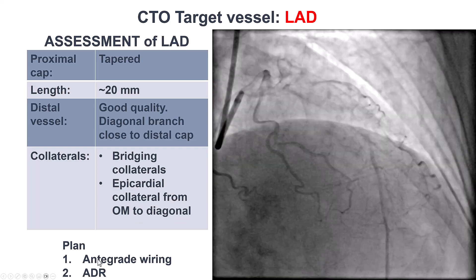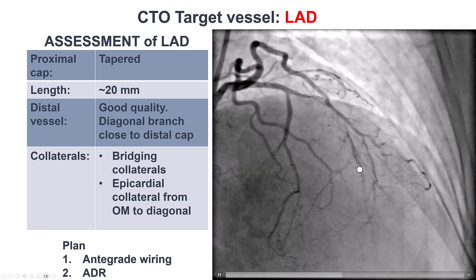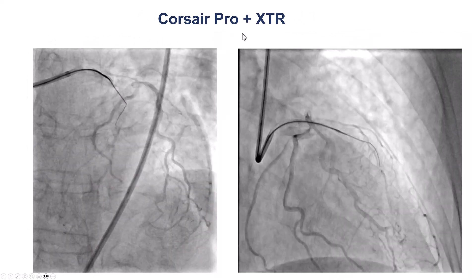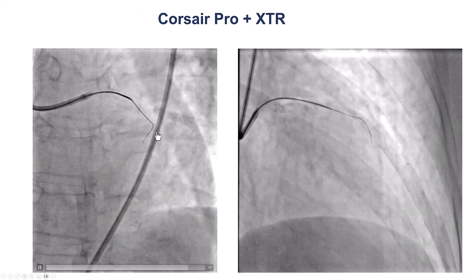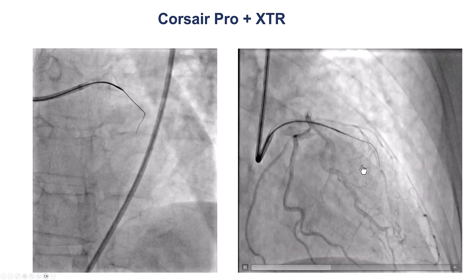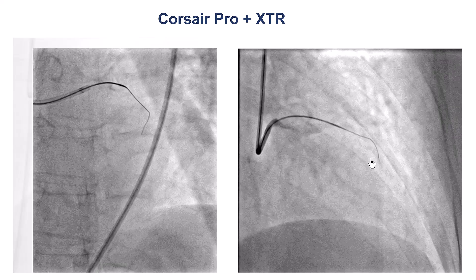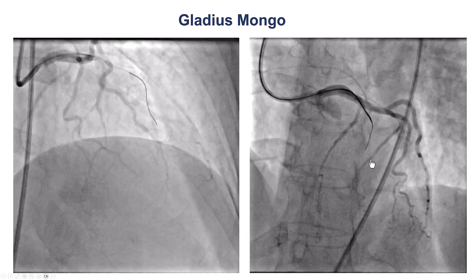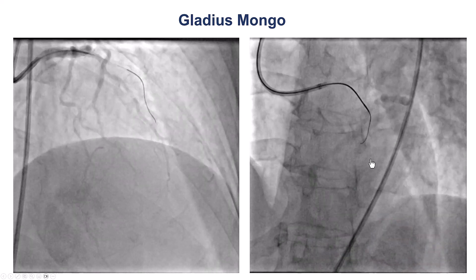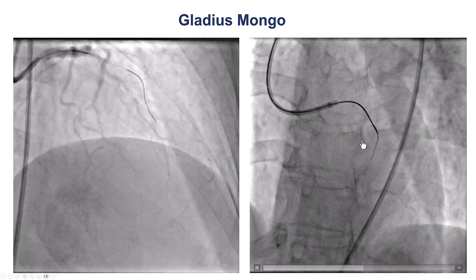We did not think that the epicardial collaterals were interventional. Therefore, we decided to first try antegrade wiring, and if that didn't work, use antegrade dissection and re-entry. We used a Corsair Pro with a Fielder XTR — a soft wire — to avoid causing any perforation. The wire was seen in the extra-plaque space, dancing in sync with the middle LAD. We then used a Gladius Mongo wire, and once again we were extra-plaque, moving in sync with the middle LAD.